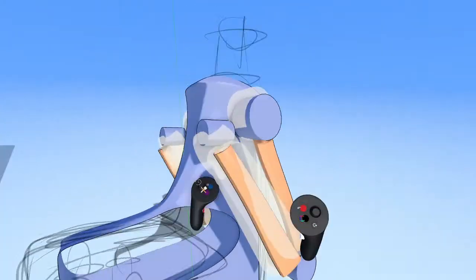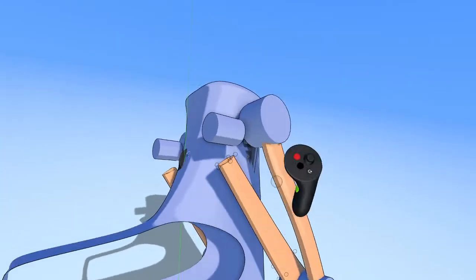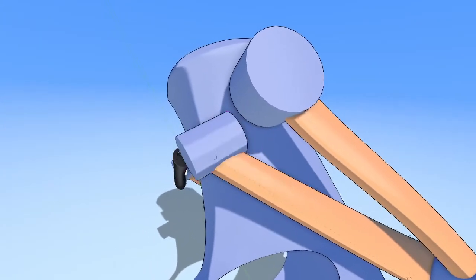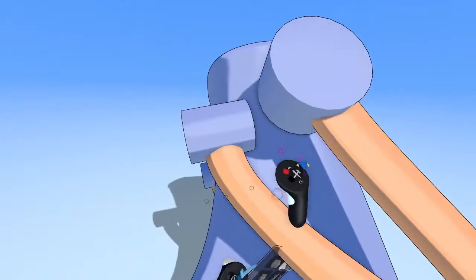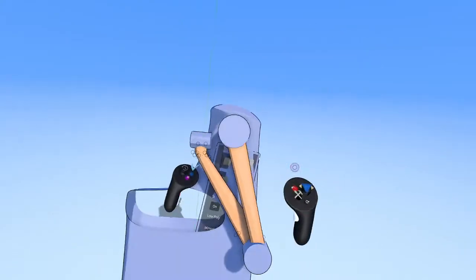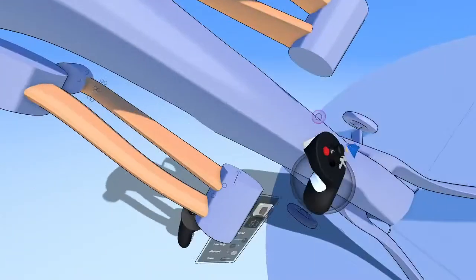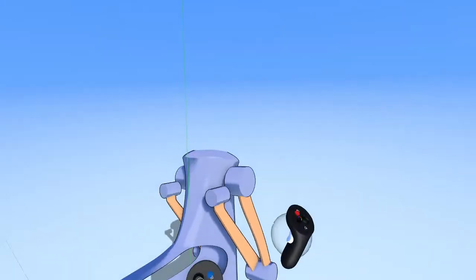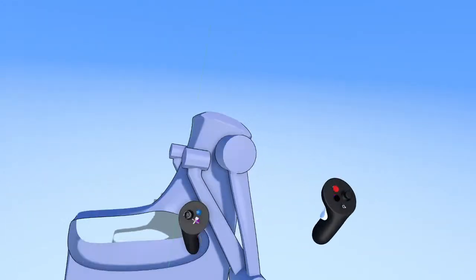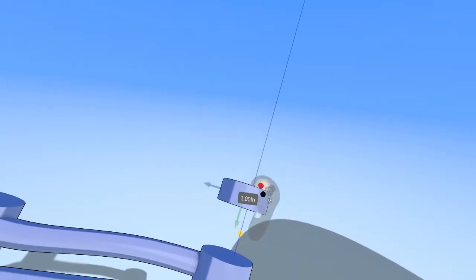And we can grab that, duplicate it, and use the same shape for the other part of the arm. Actually, let me just get rid of the sketch for the robot here so we can see that cleaner. All right, awesome. And yeah, now we can go into more depth for the elbows here.